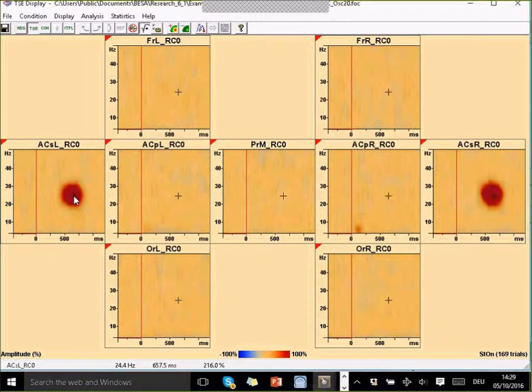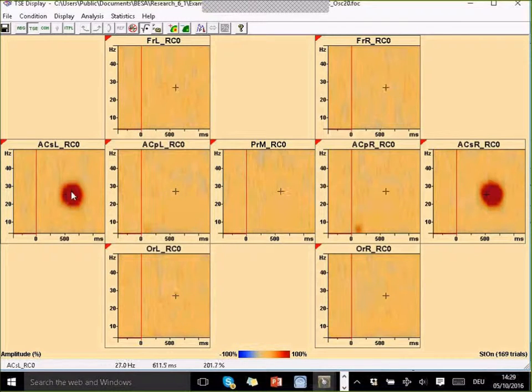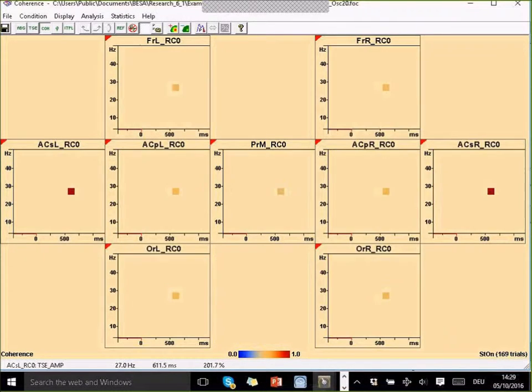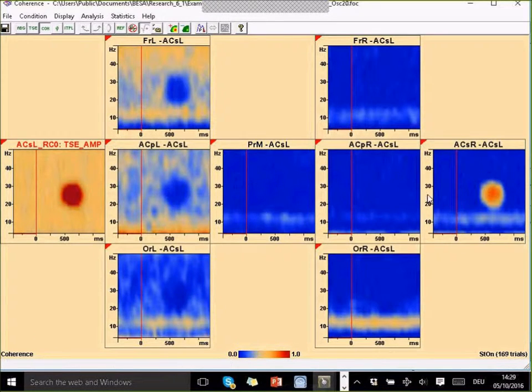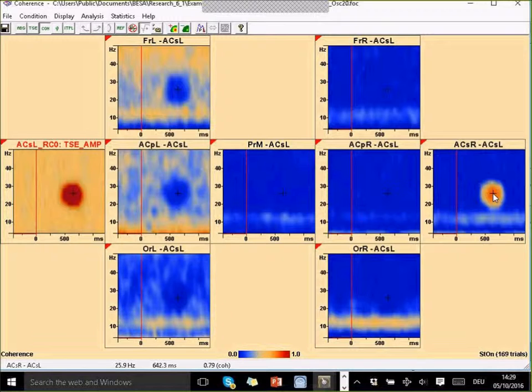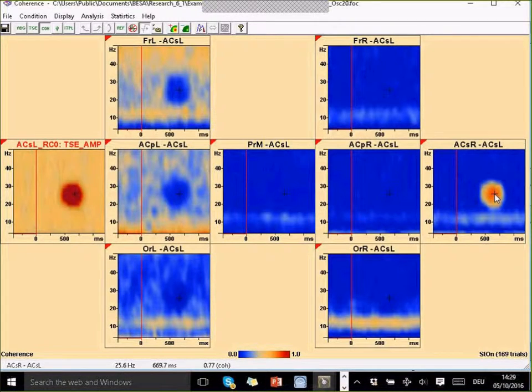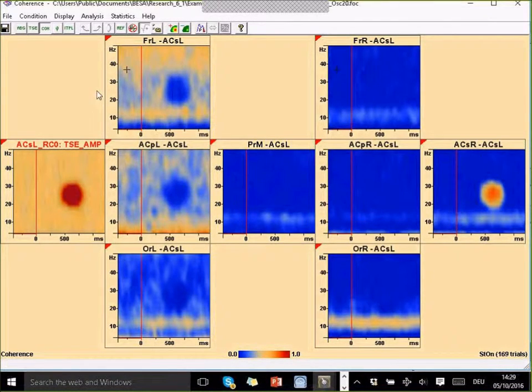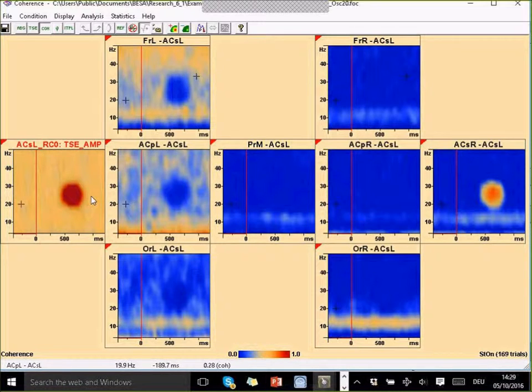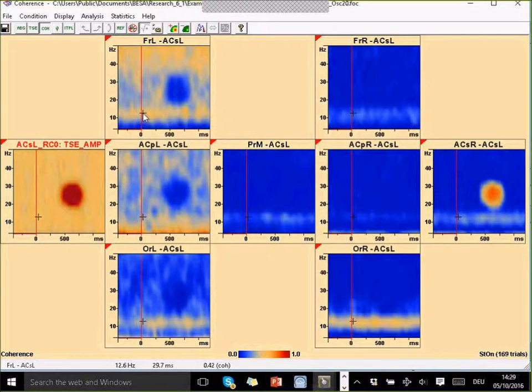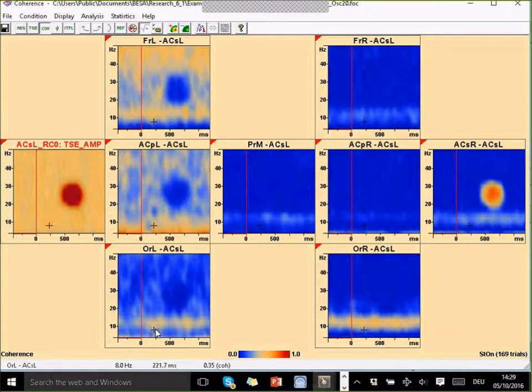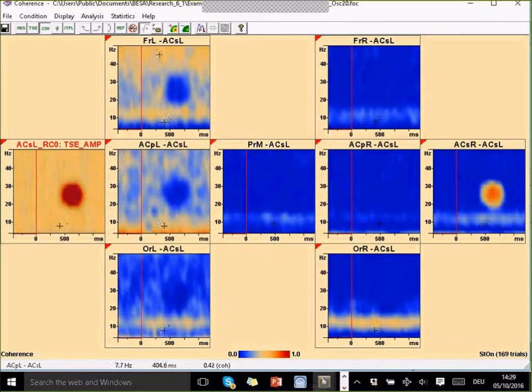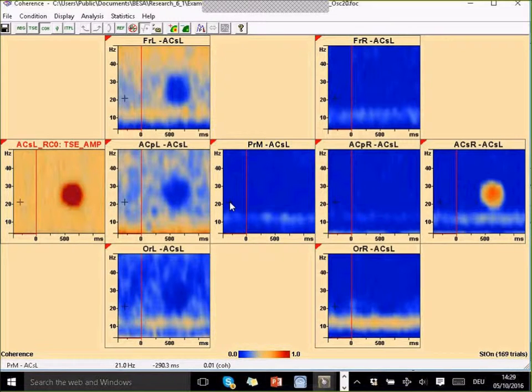I can now also compute the coherence between one channel and the others by double-clicking on the channel. I can see that this channel is highly coherent with the other oscillatory channel. It's got about 0.8 coherence value. And it's got very little coherence with any of the other channels apart from some noise that is similarly projected onto both source channels to create some noise coherence. Also I can see some alpha rhythmic coherence at around the 10 hertz range that is present in some channels because we didn't have a very good model for the alpha rhythm.